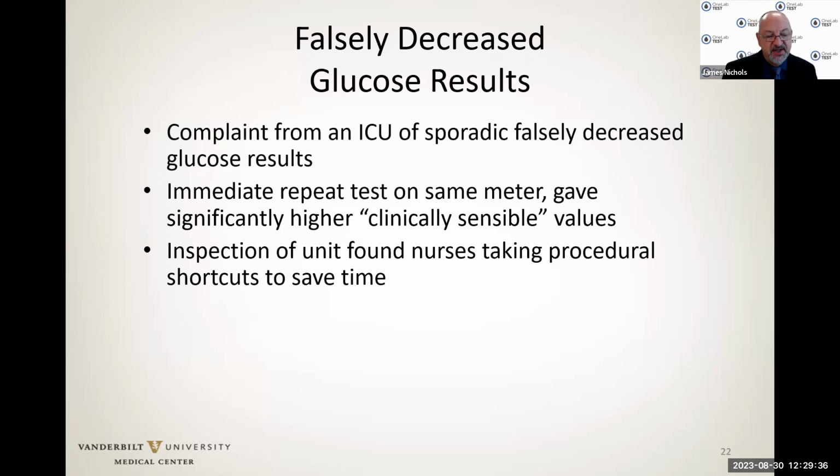They were trained to keep the cap on the bottle of glucose testing strips because they're very hygroscopic. It's humid outside during the summer, even sometimes in the wintertime with rain, snow. The humidity can go in, mix with the dry chemicals on the test strip, and cause issues with the viability of those tests.